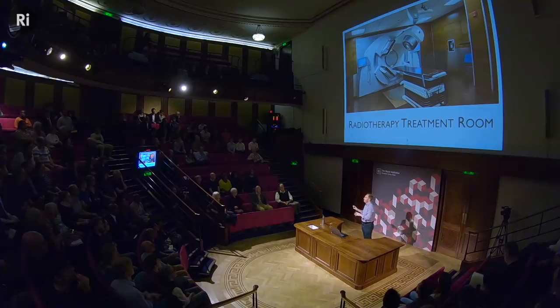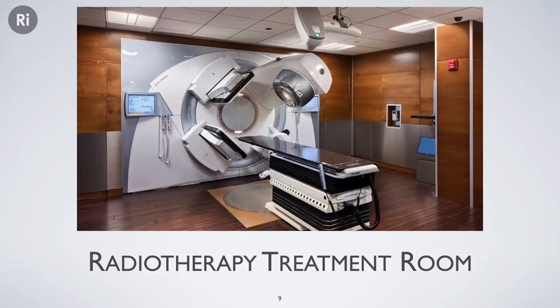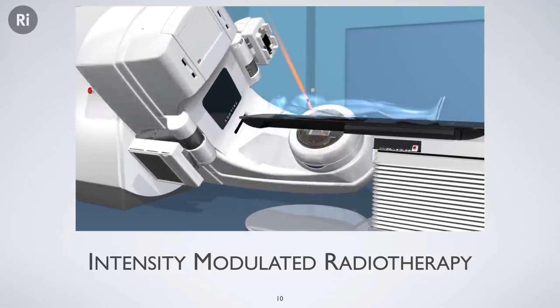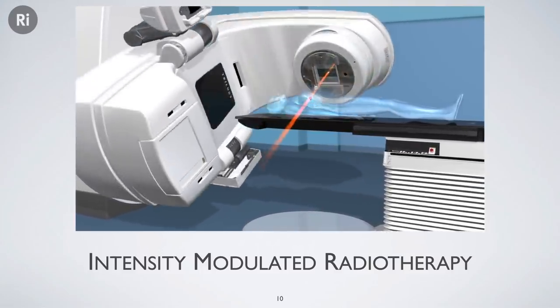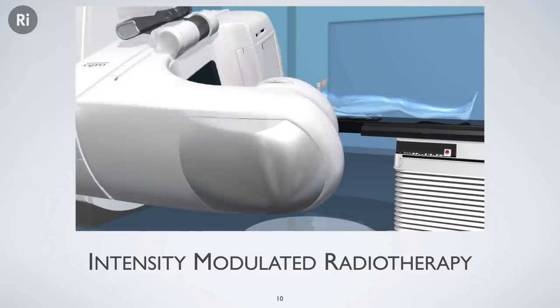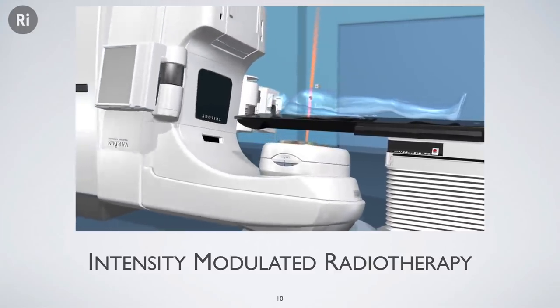Now, I'm hoping that most people in the audience have not seen the inside of a radiotherapy treatment room. This is what one looks like. What you see in the middle there is called a gantry. Now, the patient lies on that black couch, and the X-ray beam then gets emitted from all directions around the patient. That gantry emits an X-ray beam that rotates all the way around the patient. So what you actually do is deliver beams from 360 degrees. So you control the size and the shape of that beam, and that X-ray beam then travels all the way through the body, but you add up to do most damage where you want it, where the tumor is.